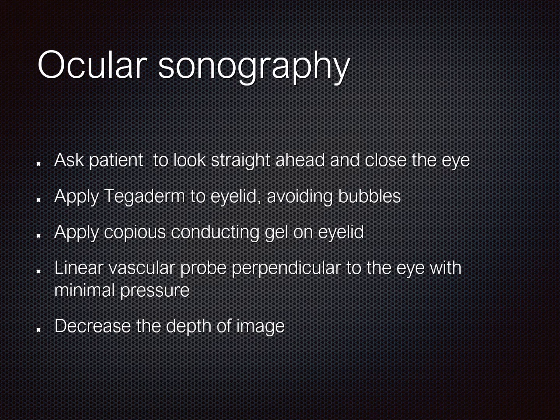Now, the Tegaderm is there to protect the patient, not really because the ultrasound gel is irritating if it gets in your eye. It's really more of an infection control barrier. And the heap of gel serves two purposes. It sort of fills the cavern created by their forehead and cheekbone, and it also helps make sure that you aren't putting too much pressure on the eye, because that can be quite uncomfortable.